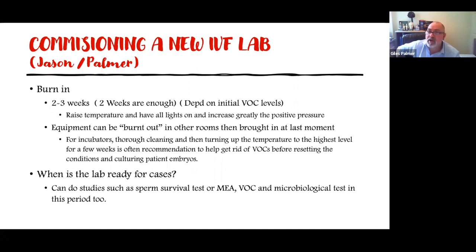And a little trick, which also works well if you have large equipment, is to have almost like a false wall or a larger than normal door, so that lab can be aerated for 2 weeks.